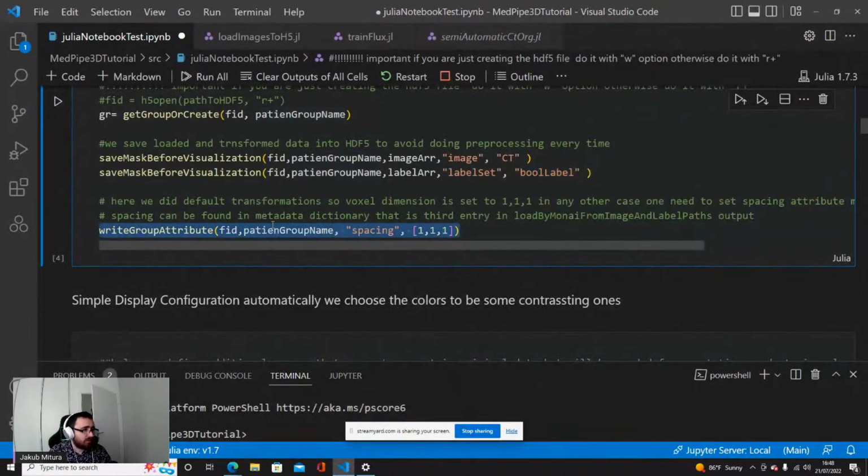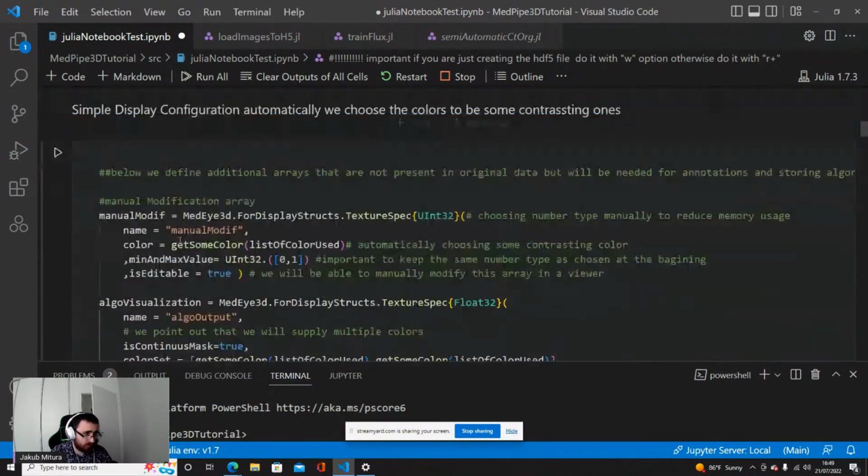And we also write the group attribute spacing. You can add any other that you want. The spacing is required, but if you need something else because your data has some special metadata, you can add anything that you want by writing this group attribute and then retrieve it easily.